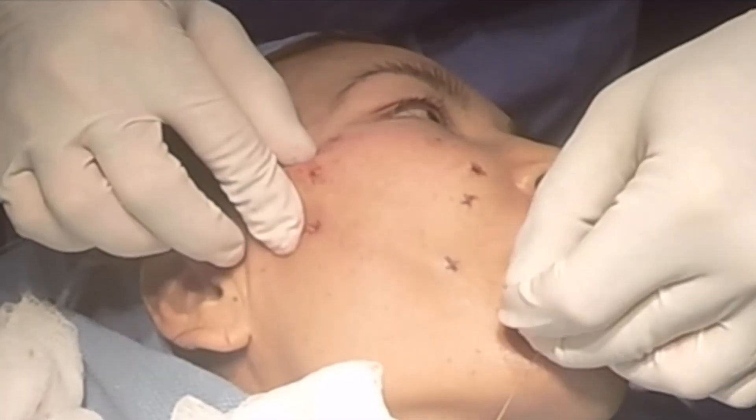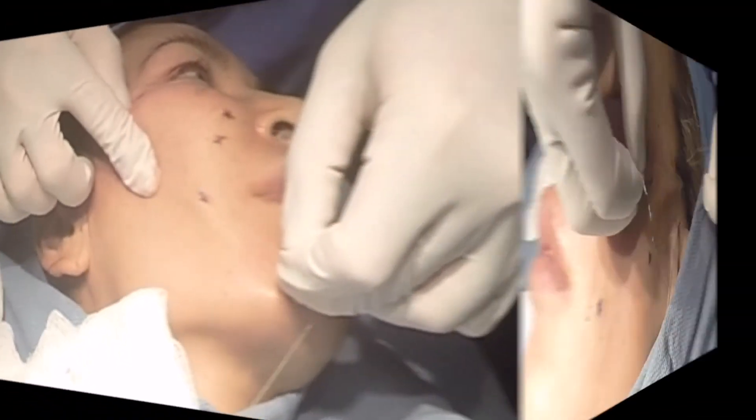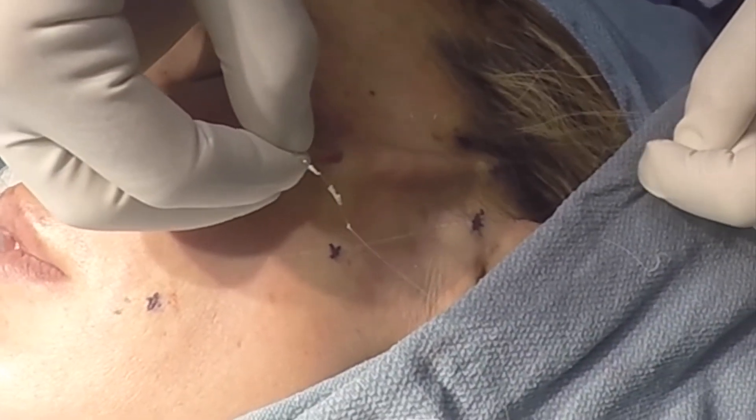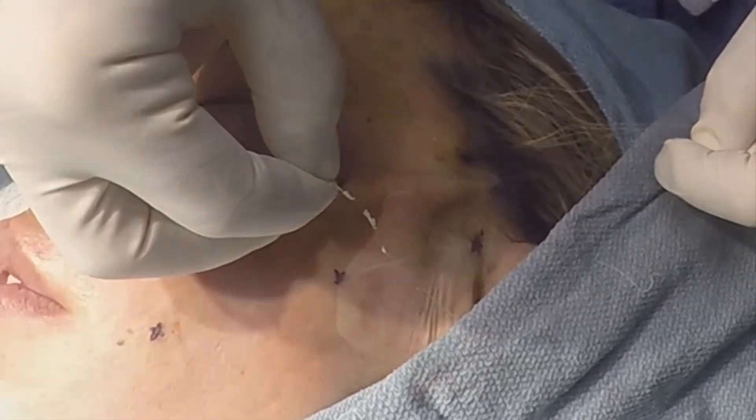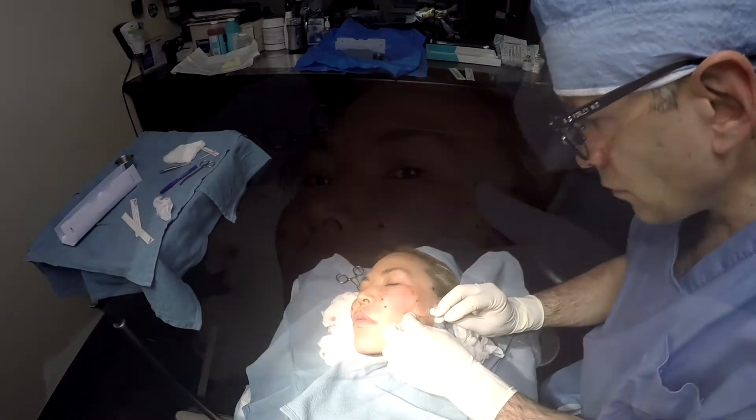The suture and cones become encapsulated by collagen, which creates biological fixation of the lift that has been achieved. It is locked into position by your own collagen and no longer depends on the InstaLift sutures for longevity.